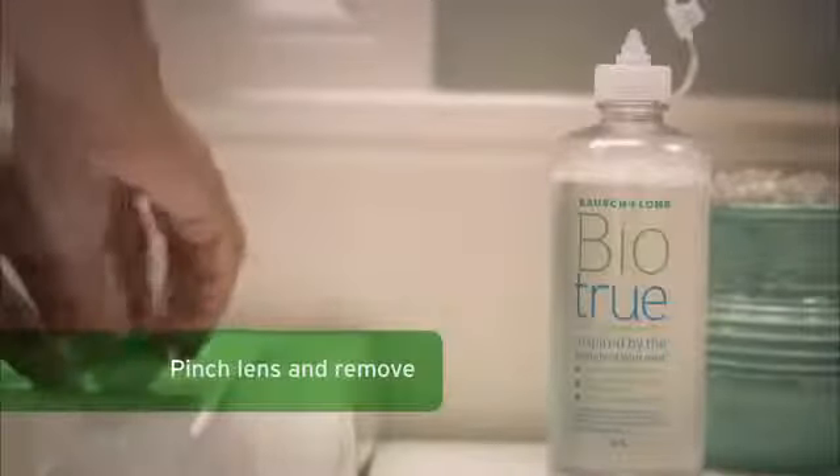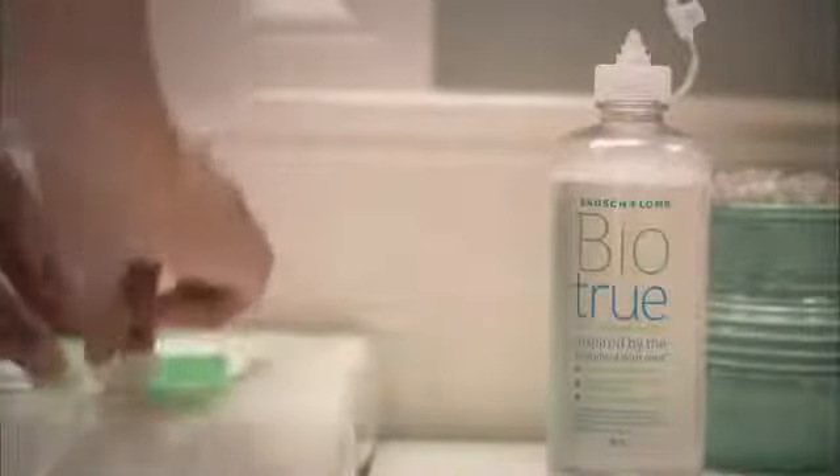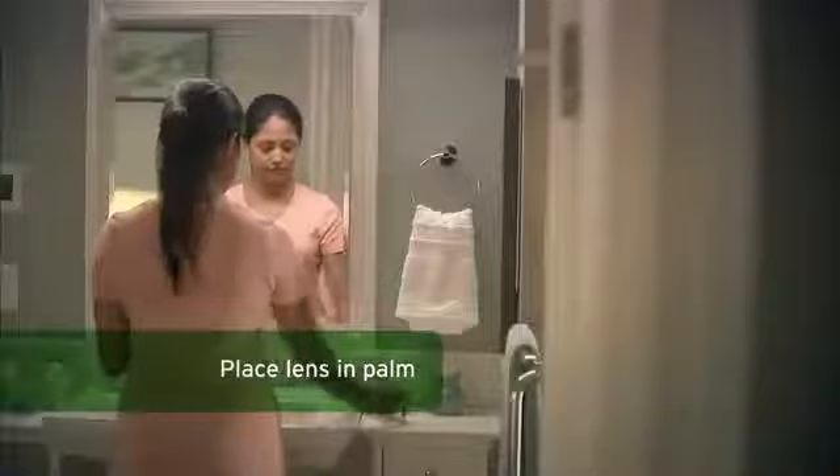Next, unscrew the cap of your lens storage case and remove the lens by gently holding it between your thumb and index finger. Place the lens in the palm of your other hand with the edges facing up. Once the lens is in your palm, rinse it with BioTrue Multipurpose Solution to remove any debris.